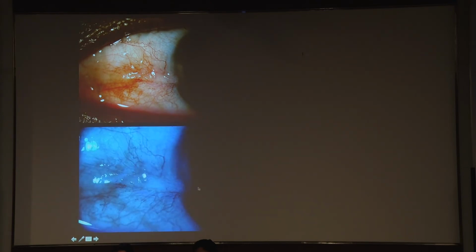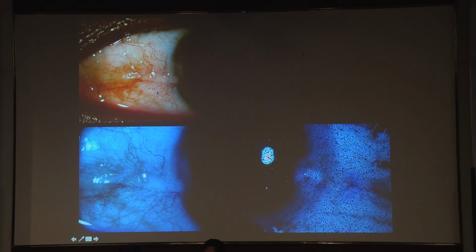Now this was another person who came to us, referred by my nephrologist, who had been complaining of these whitish lesions. You can see it's just a linear lesion with not really dilated vessels, but when you look up close and I stained him, he had these fine punctate stains on rose Bengal. That even alarmed me, because it looked suspicious until we stained him on the other side and got fine, proper punctate staining on the lesion.